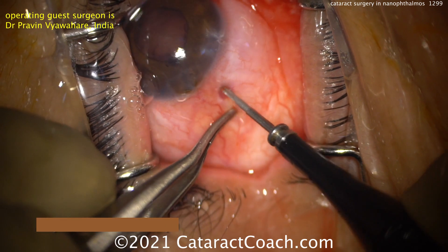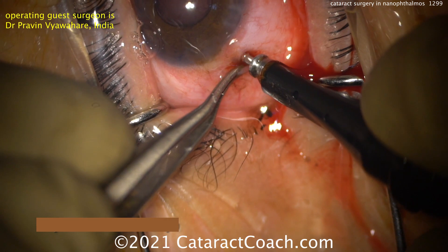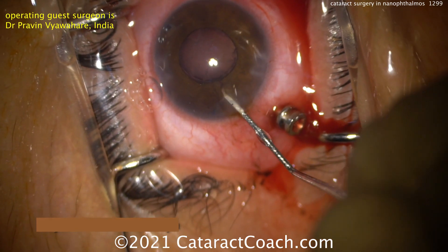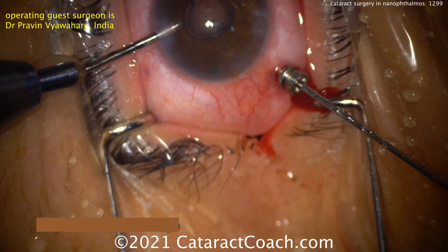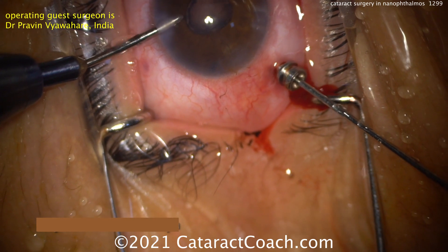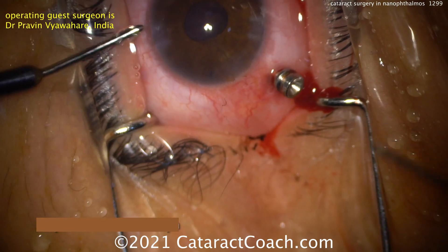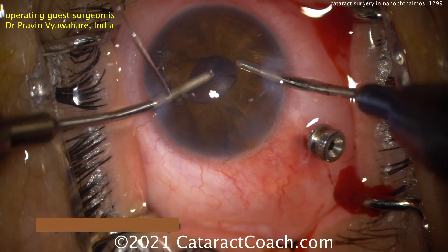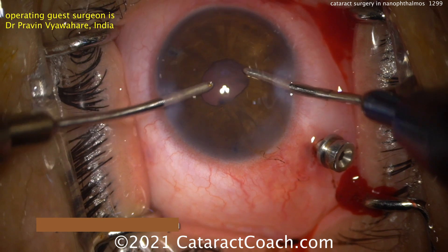Now he's going to make a pars plana entry with the trocar. Be very careful in the 15mm eye — where is the pars plana? It may be very tiny. How do you know you're not putting the trocar through the peripheral retina? Check carefully. When you take the trocars out, look at that entry site with your indirect ophthalmoscope. It looks like he's doing a little bit of anterior vitrectomy to deepen the AC and give himself a little more room to implant the lens — and sometimes that's needed.